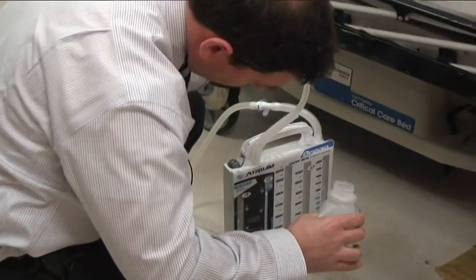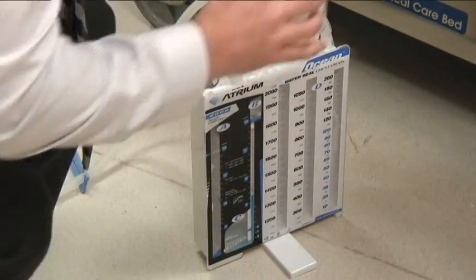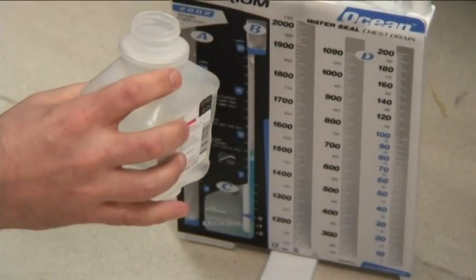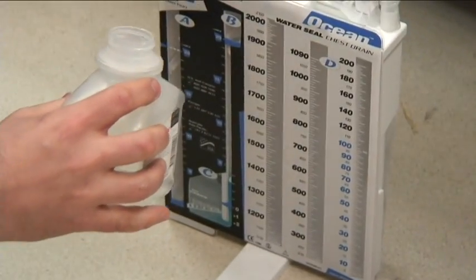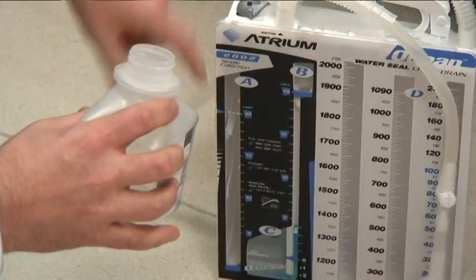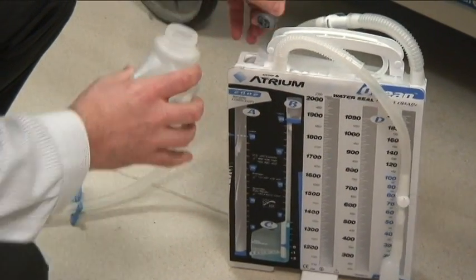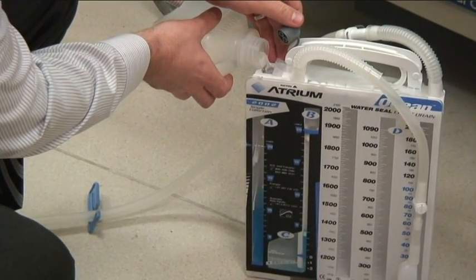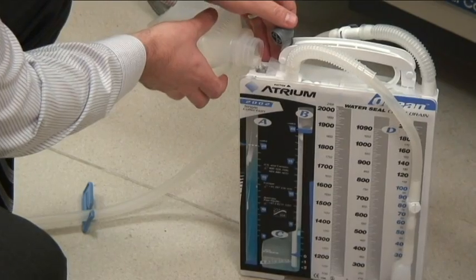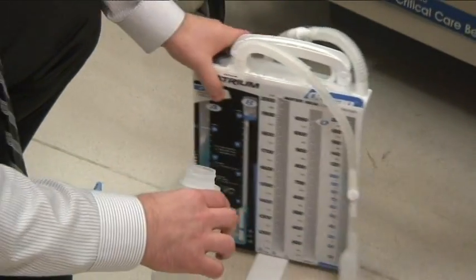And it turns blue automatically. Add a little bit more. Okay, and that should be good. Make sure it's distributed. And it is. And then you also want to add water here to limit your suction. So normally we put it somewhere between 15 and 20. That should be fine. Okay, so now this is ready.